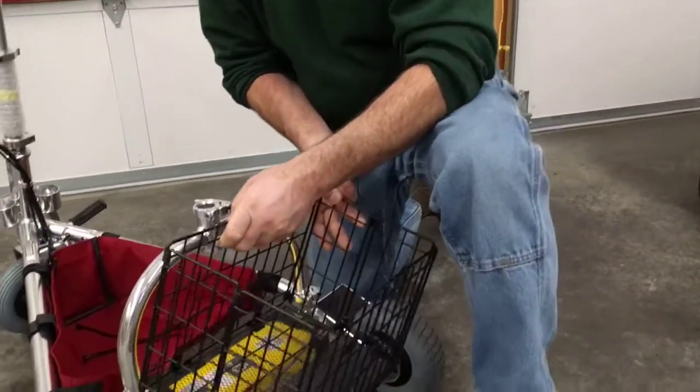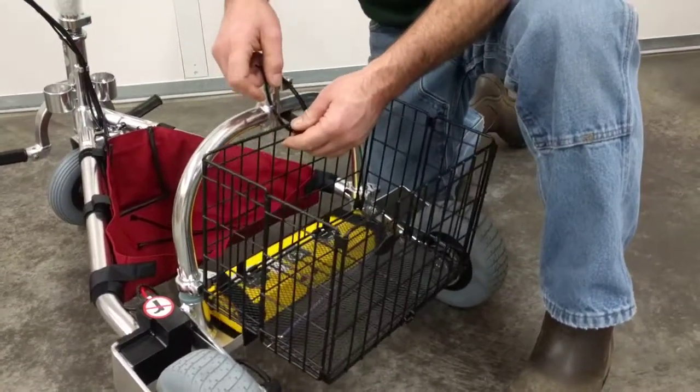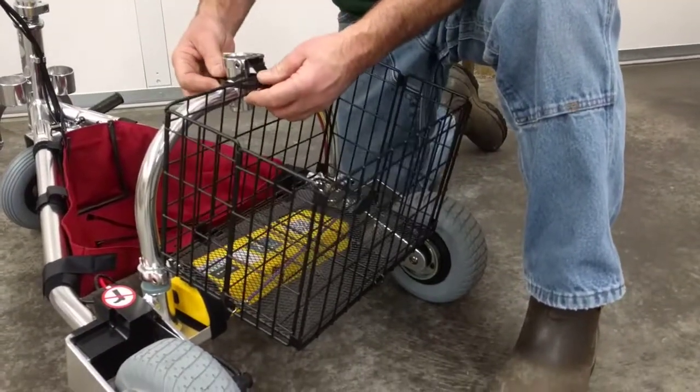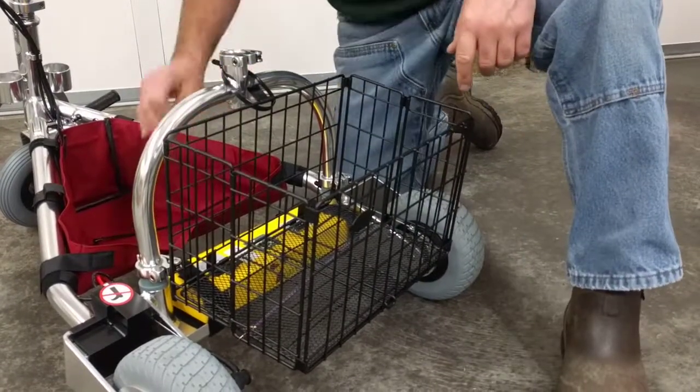Now take your basket, just set it on top of the battery, take your releasable cable tie, just drape it around your yoke. That's as simple as that.